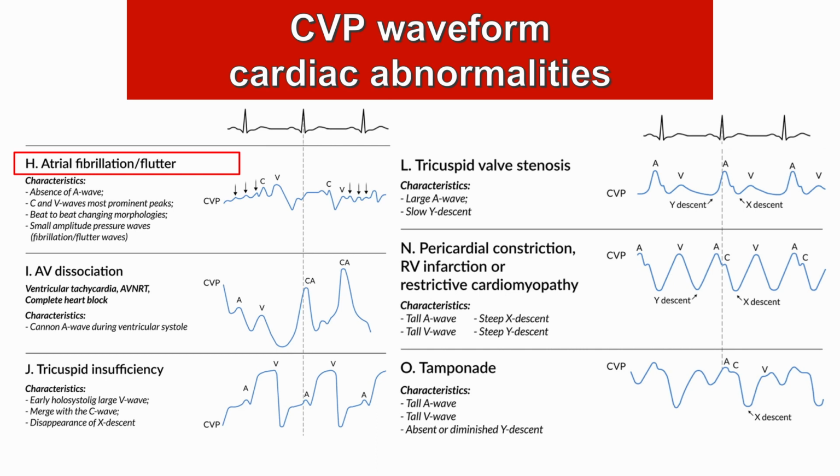So this is useful if your patient goes into AF. You should definitely do a 12-lead ECG. We should be able to tell from the ECG. But if it is a tricky one, you can look at the CVP waveform as well, and you'll see this example where those little arrows are showing the fibrillatory wave instead of the A.